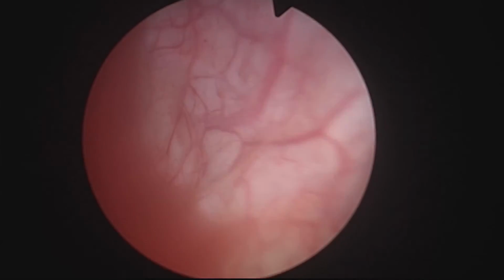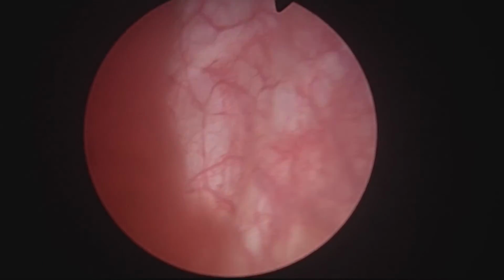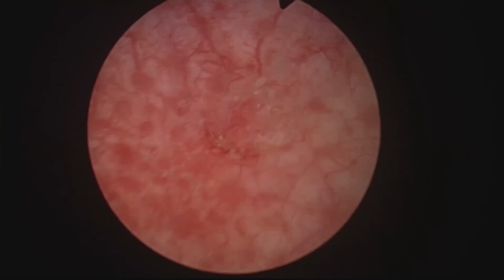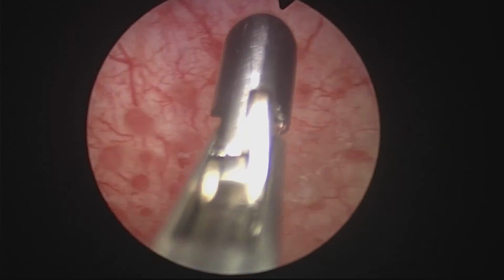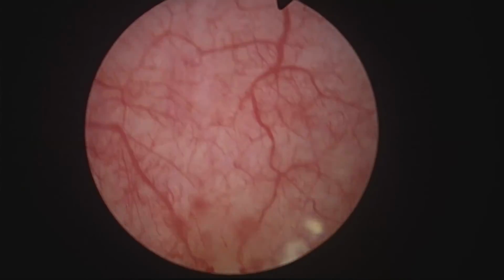For a moment, I couldn't find it. So I took out my view from the diverticulum, and then I had to put in the biopsy forceps, gold biopsy forceps. And there it is. And look at that. Stones inside diverticulums are not good news. So I decided to take some biopsy to send to the pathologist.